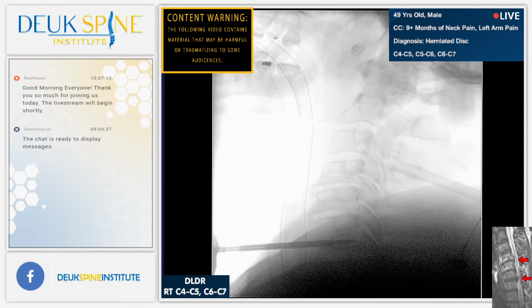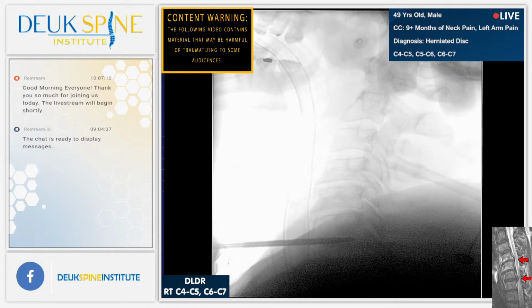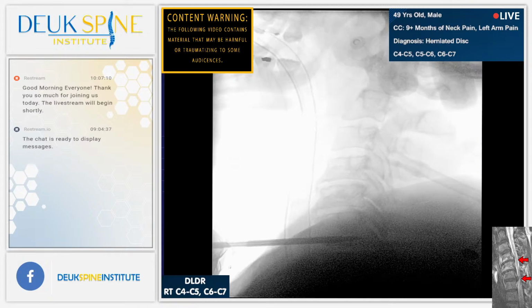That happens because of pressure inside the disc. There it goes again. That's abnormal pressure. What's causing it is inflammation. Everyone has had inflammation before in their lifetime. Inflammation is swelling and increased blood flow.